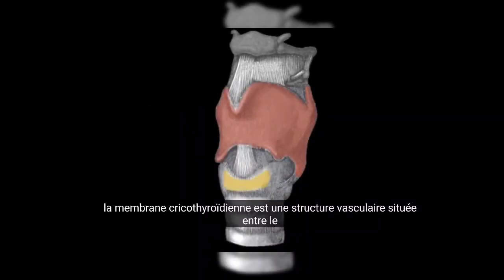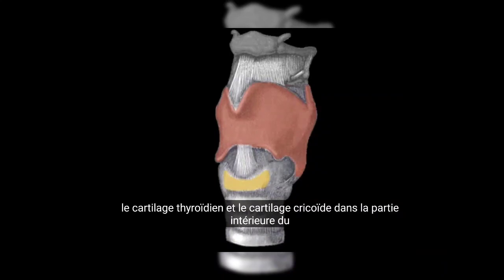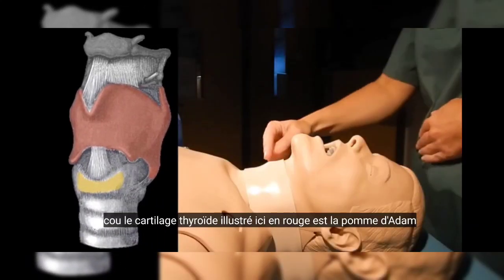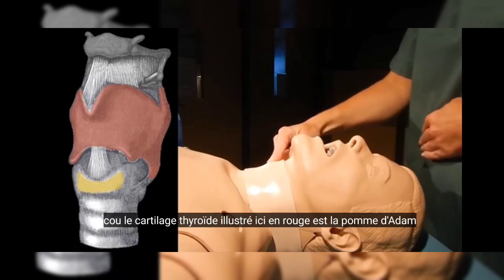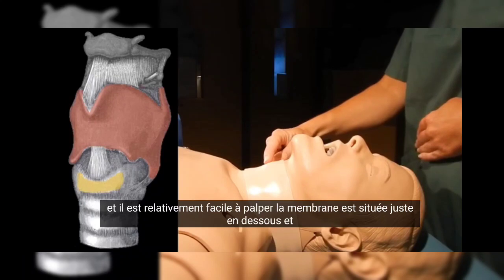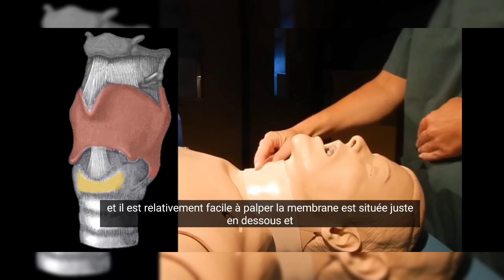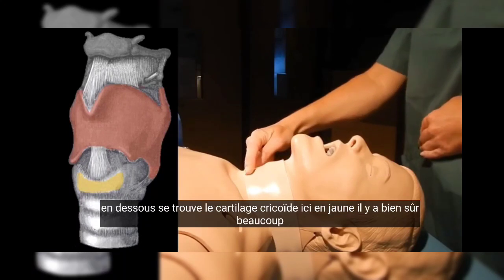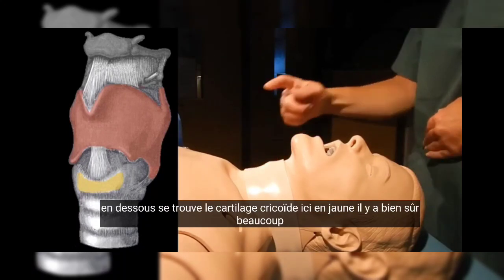The cricothyroid membrane is an avascular structure situated between the thyroid cartilage and the cricoid cartilage in the anterior part of the neck. The thyroid cartilage, here illustrated in red, is the Adam's apple, and it's relatively easily palpated. The membrane is situated right below it, and below this is the cricoid cartilage, here in yellow.